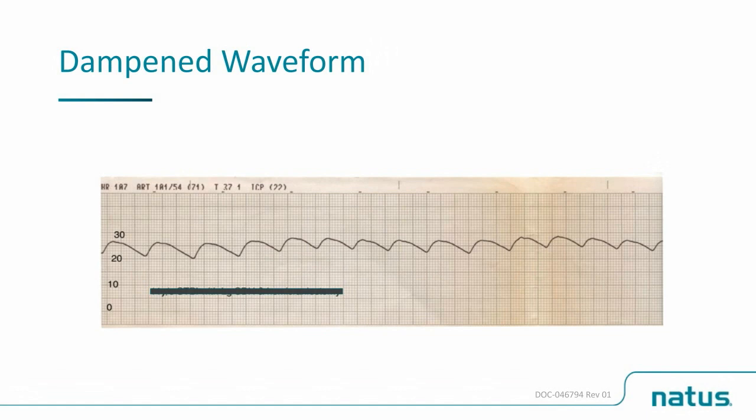This is an example of an ICP waveform after a hemicraniectomy, meaning there was a piece of the skull removed to help prevent secondary injury and herniation from increased intracranial pressure. You can see that there isn't a discernible P1, P2, P3. It is important to note that a patient with a bone window or craniectomy can still have increased ICP, decreased blood flow, secondary injury, and herniate.